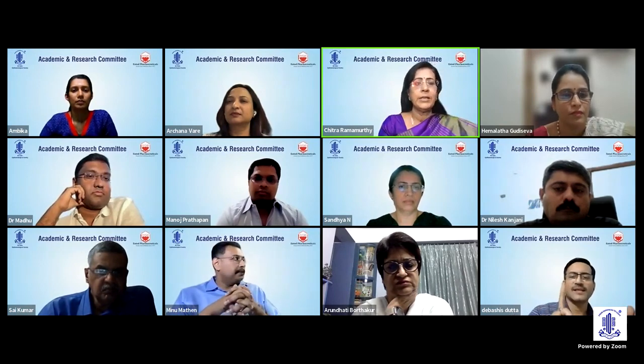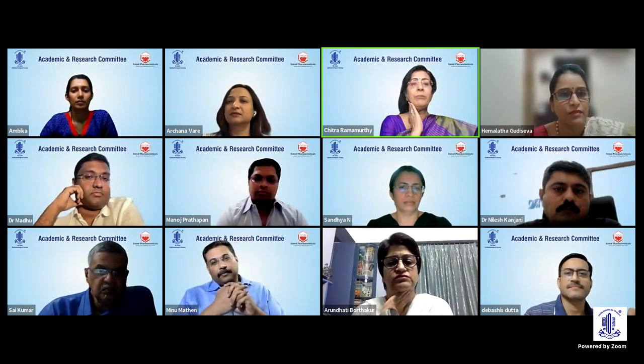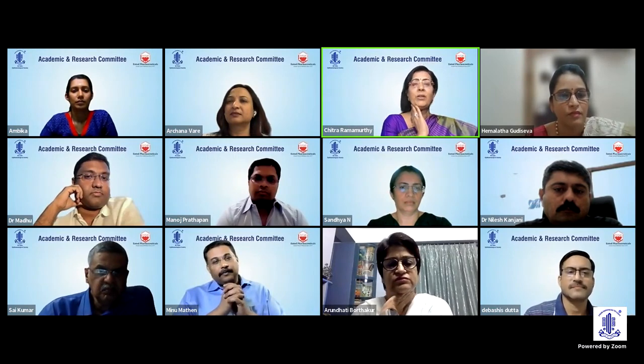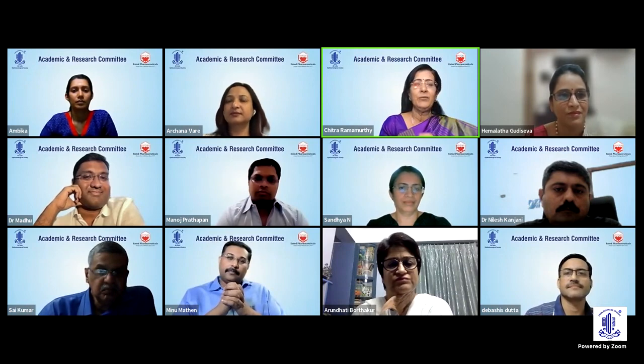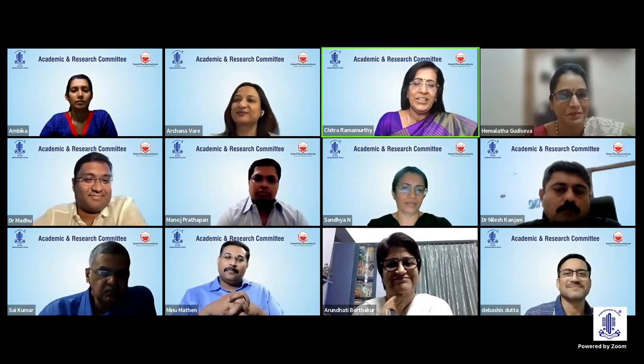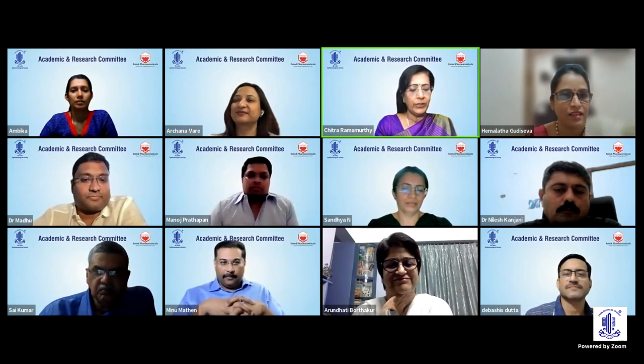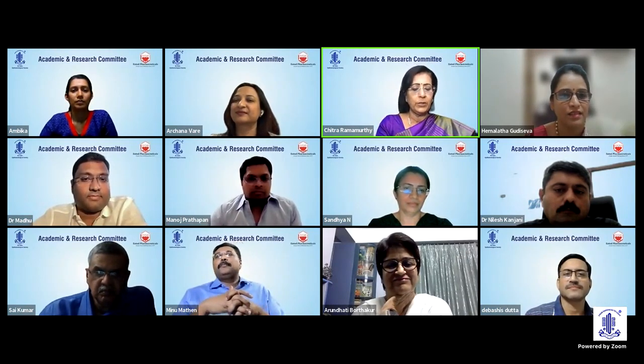Yeah, wonderful points. And actually, Hemalata, your case was good. Talking about toric and bringing up these things is not finding fault. It's just that I want to energize the expert panel to come with 1, 2, 3, 4 points like what happened now. Yes, ma'am, very nicely done surgery. It was so clear that your phaco parameters were very optimal and the surgery was below the iris plane.